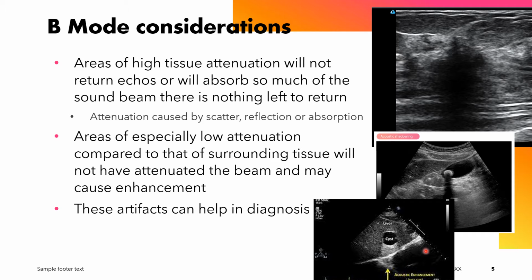Now, on the opposite end of this spectrum is the case where we have something like this cyst here that has an anechoic material within. And so as we emit sound across this whole face of this transducer, and all the sound progresses through the tissue, the sound in this region and the sound in this region are going to be attenuated every step of the way. However, the sound here in this central region will reach the cyst, and once it's in the cyst, none of it will get attenuated. So when we get to this more posterior field, we see that we have more echo or more amplitude in our sound wave down in this region than we do here and here, because no attenuation occurred in this particular portion where the cyst is present.